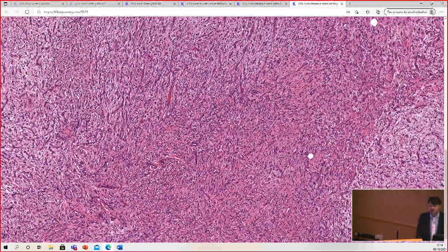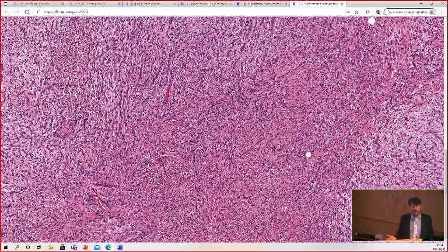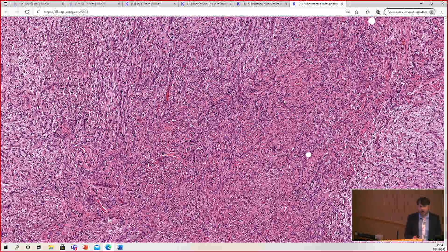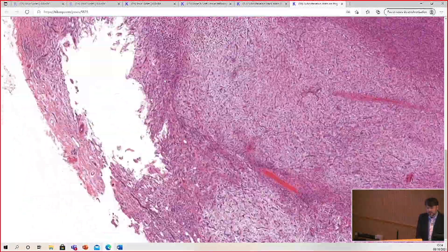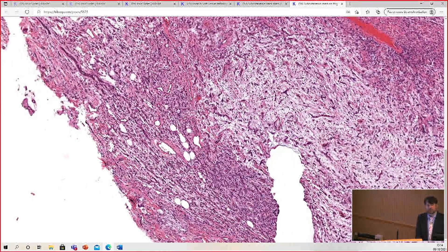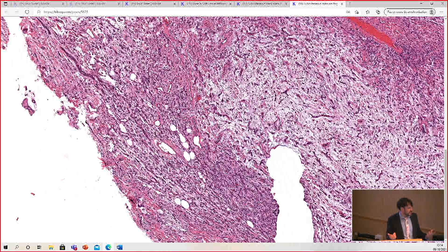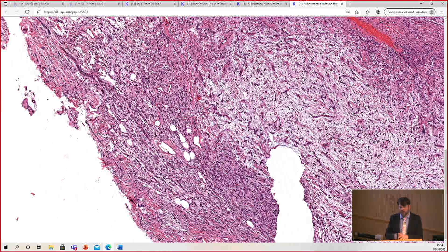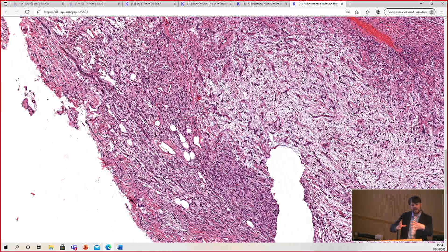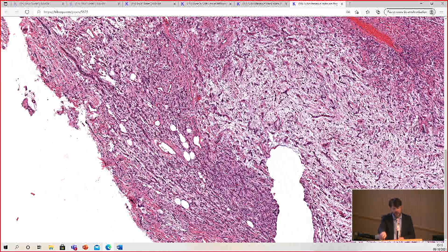The other problem is that this tumor sometimes expresses CD34 — this particular case was mostly negative. Because of that, plus the fat entrapments, you could potentially think about dermatofibrosarcoma protuberans. But not really — you'd expect a more swirled storiform pattern for DFSP. I've seen dilated prominent staghorn or hemangiopericytic vessels in DFSP, but never one with these little delicate prominent branching vessels. So I feel like this tumor doesn't look like much else.